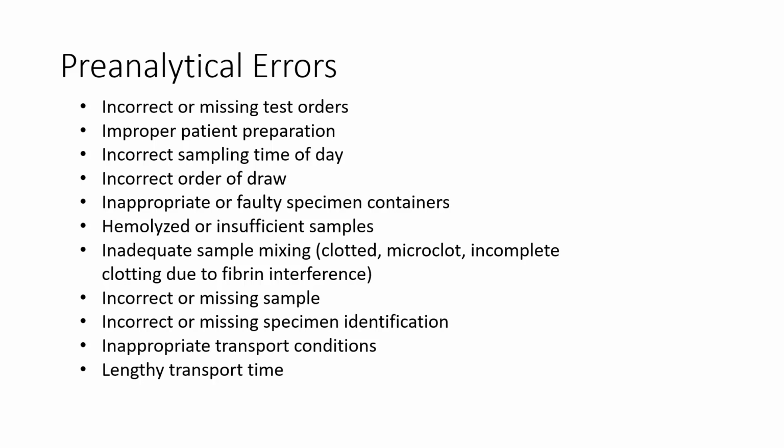Or faulty specimen containers. If the caps weren't completely on the tubes when they were sent down to the lab, they could leak all over the bag and then we can't run those samples.